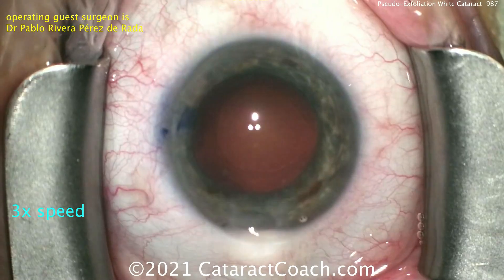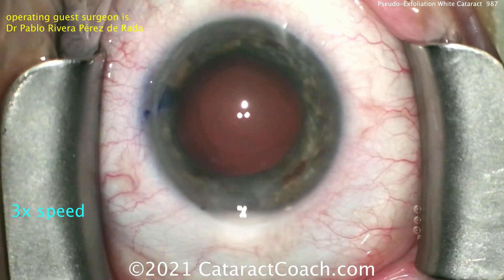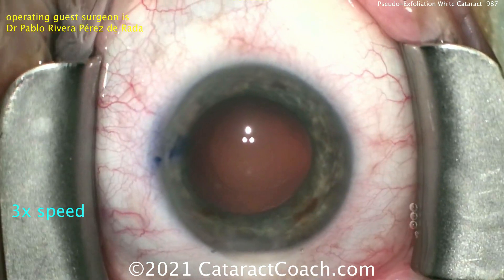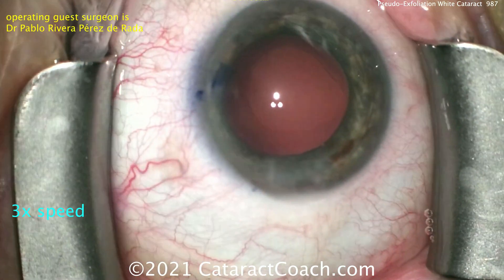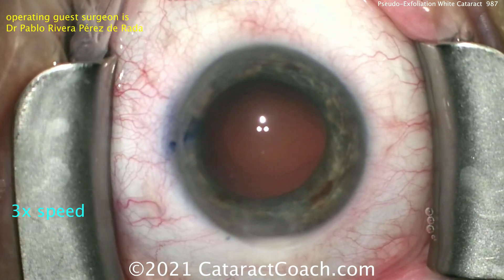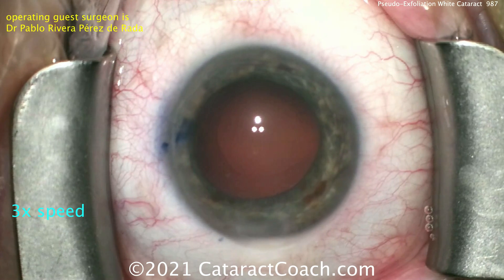Viscoelastic to inflate the capsular bag, and now I'm going to insert the IOL. You see the surgeon's hand there — maybe some manipulation or loading of the lens. But again, I wanted to show you the video in real time so you can see. Now, if you're doing 350 cataracts, if you're about that range of training, this is about where you should be.